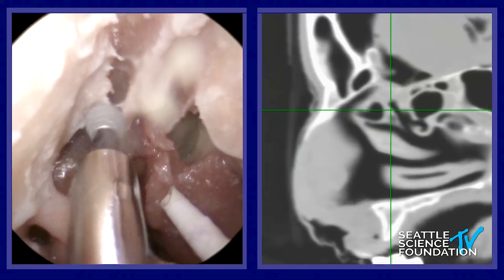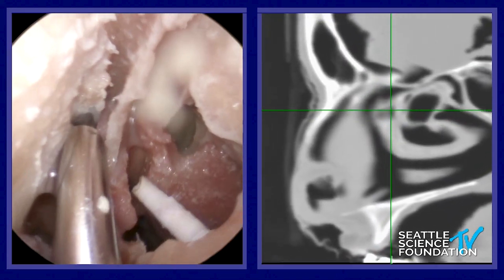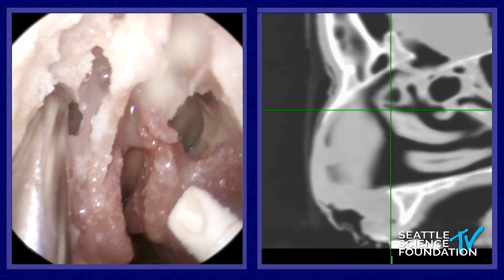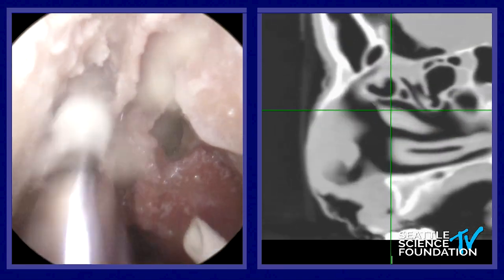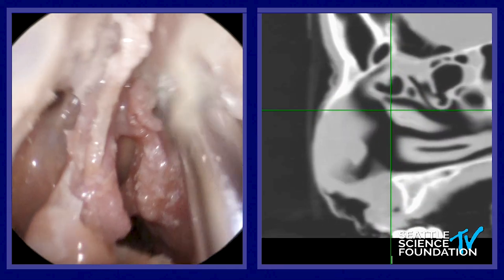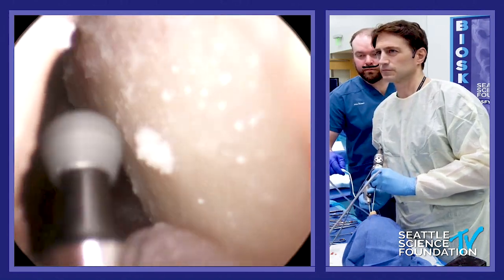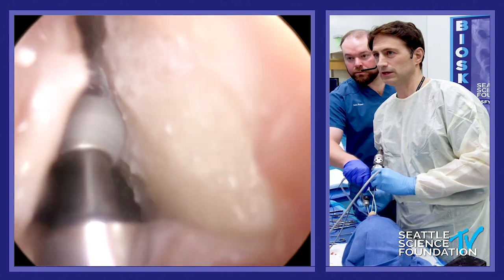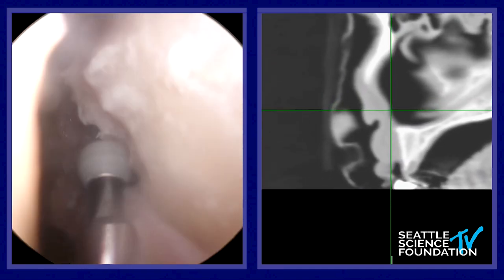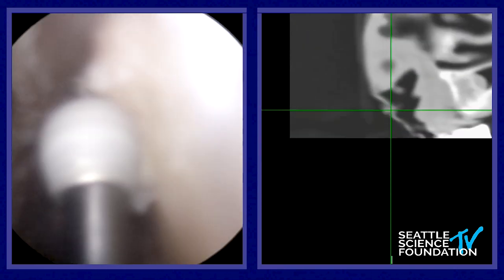I'll often use a cutting burr for this part because it's so rapid. Look what I can do — here's the frontal, I can get in behind it and essentially just drill the crap out of this front part right here, and it makes it super simple. It can cross over — I can just drill through the floor very easily right to the front and come cross court. You've got to drill that lateral stuff to get your width. You can get down to the periosteum.